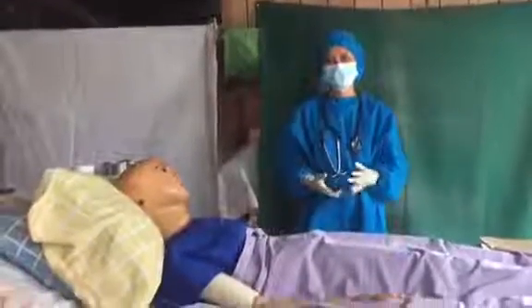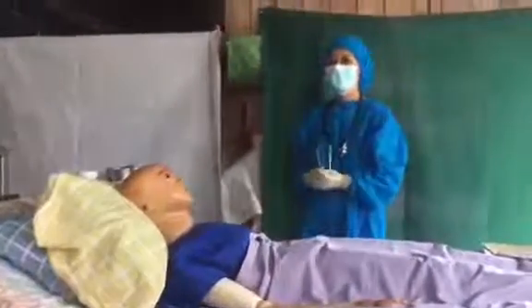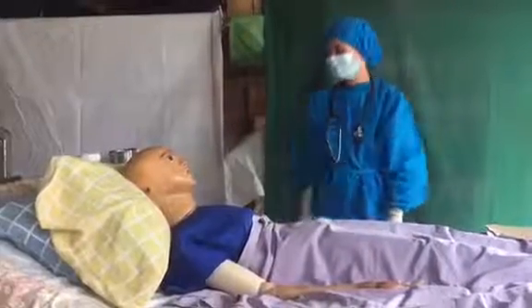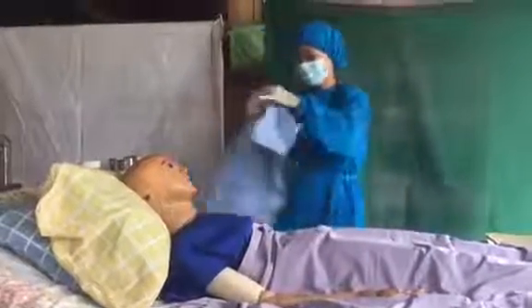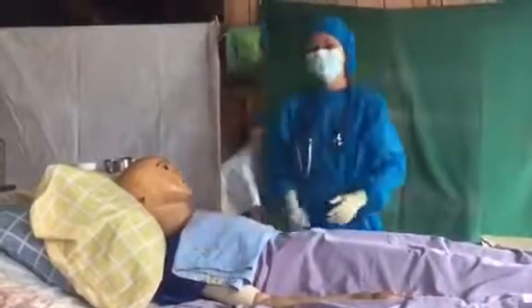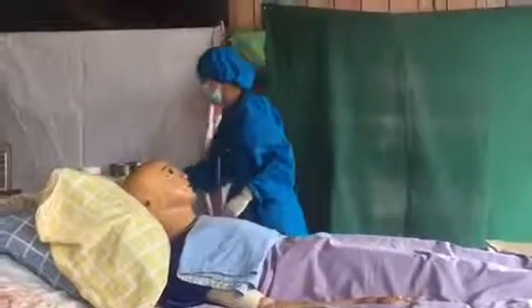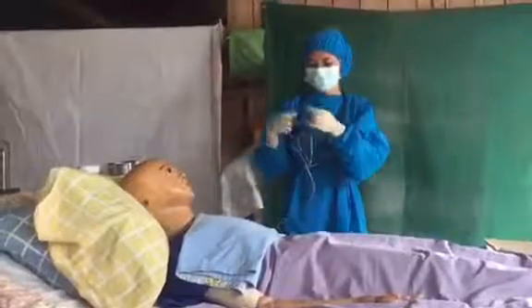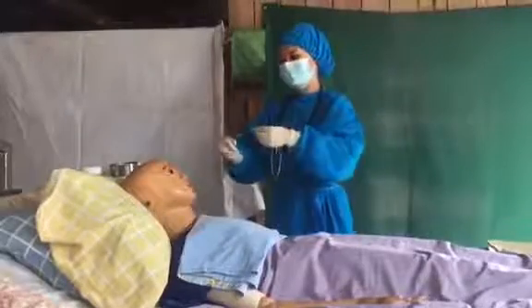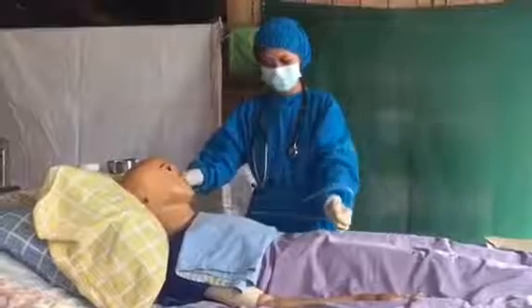Assuming that I'm done preparing all the equipments and done performing hand washing technique, and make sure that you wear gloves. So now I'm going to insert the NGT tube. Firstly, get the towel to avoid messing the patient's bed or dress. And next is get the NGT tube. Okay, so roll the tube. Measure from the tip of the nose to the ear and ear to the stomach.